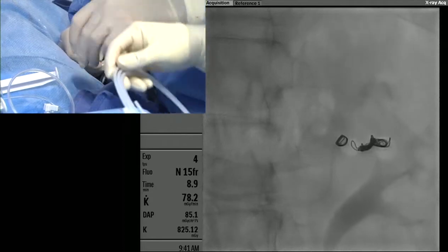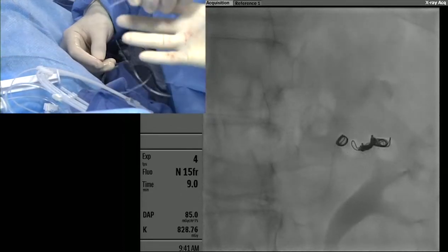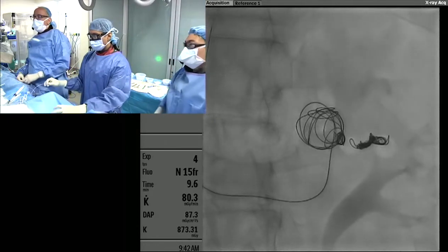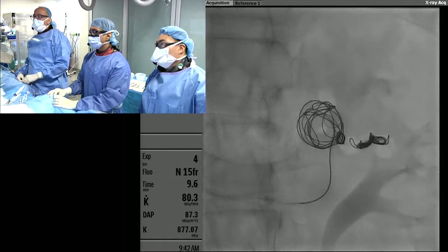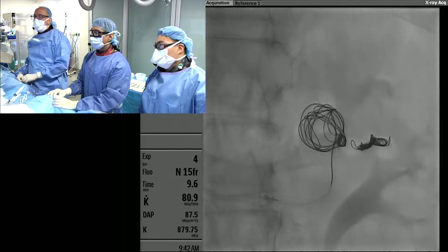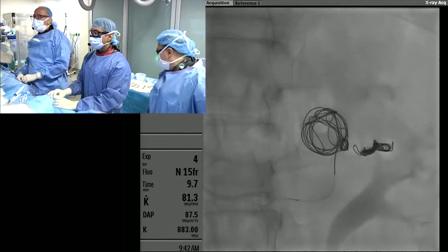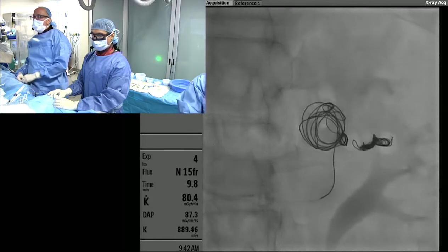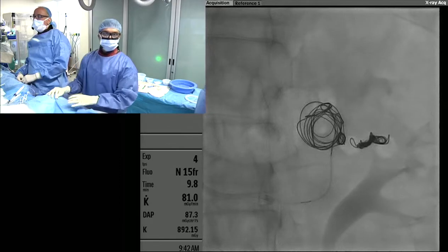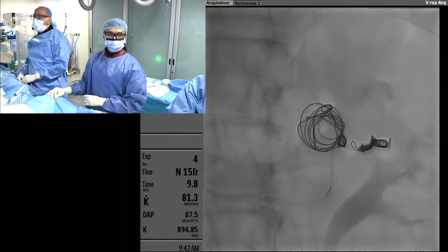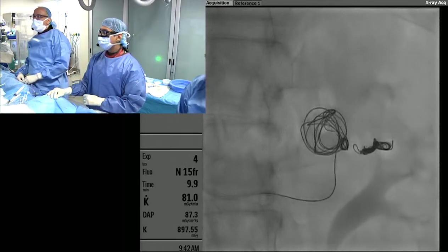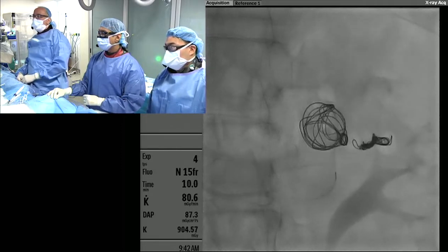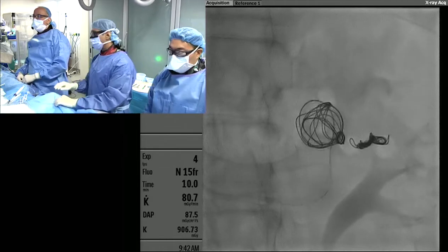I'm going to shift to larger coils to fill up the aneurysm. This is a very long Interlock coil — it gives you an idea of how with one coil you can fill up so much space within a complex aneurysm. It's still not out of the microcatheter so I can reposition it and wait until the last second to detach it. It's a nice demonstration of how with very long technology you still have full control.